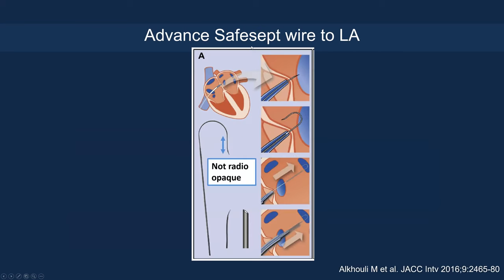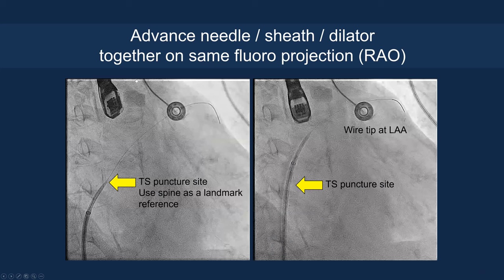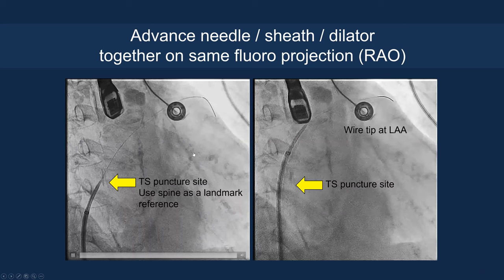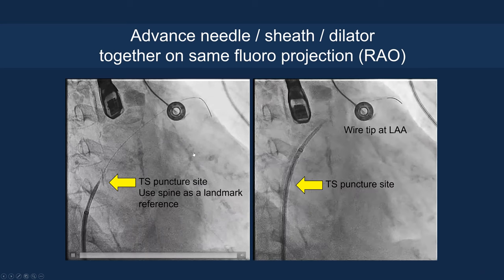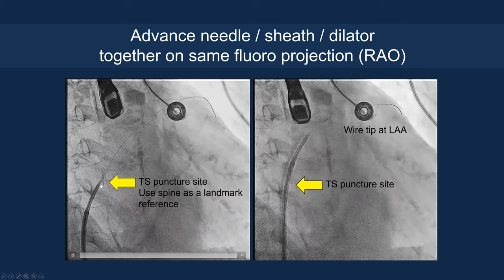This shows advancing the SafeSept wire to the left atrium — it is a mechanical, very fine, atraumatic needle. You can do this mechanically or with the Baylis radiofrequency needle. Once you puncture, perform an x-plane of the aortic root short axis to confirm you are in the mid-septum. You can see the trajectory of the wire across to the left atrium. Advance the needle and sheath dilator together on the same fluoroscopic projection, noting the transeptal puncture site, then advance the sheath knowing you are in the left atrium.